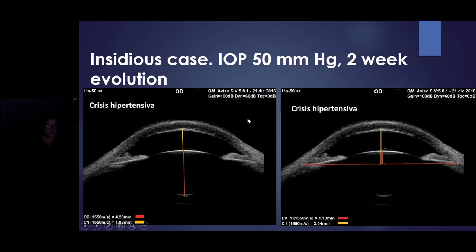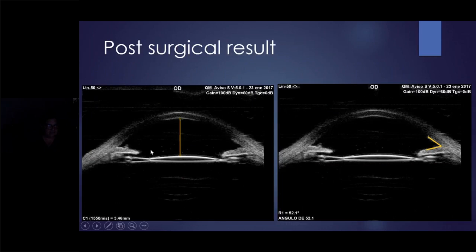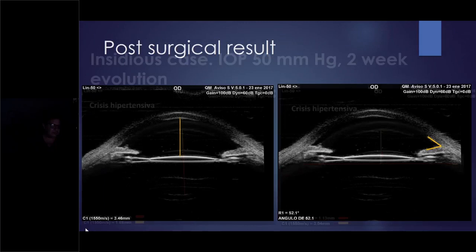They're the people who go to the movies and get headaches just because of the dilation of the pupil, and they are making episodes of closure of the angle. We made the operation. Look, one month later, it's a big anterior chamber, but there are still synechiae here. What happened? They waited a long time. All the people say, no, you have the risk, but we don't do anything until you have a big cataract. And then the complications are worse. In this case we operate, because what you see in the cornea is quite different, with edema and without, and we must operate this case as an emergency.